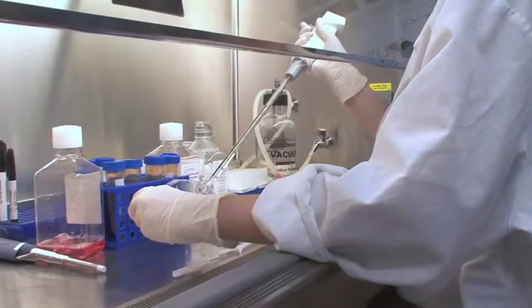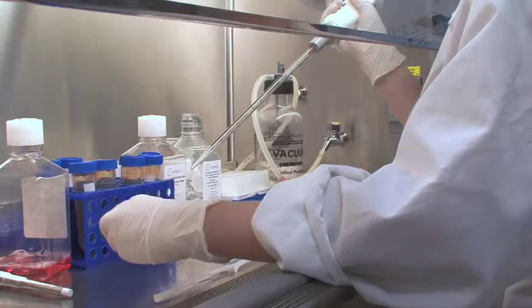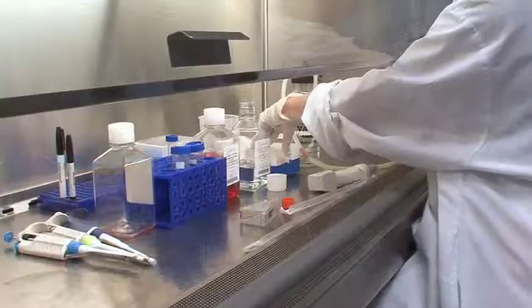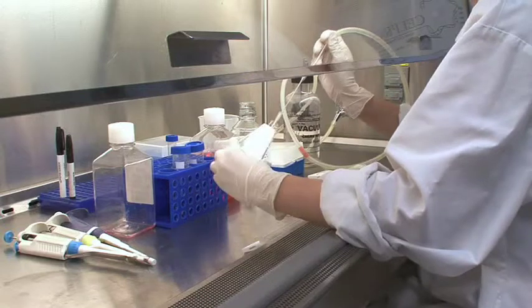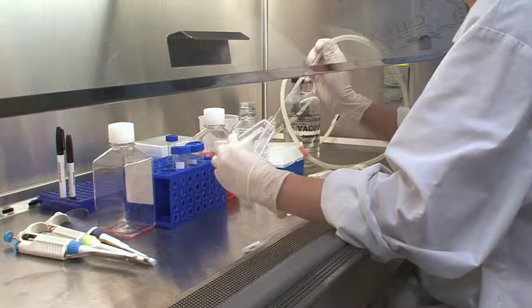With the remaining attached cells in the T75 flask, wash with 3 milliliters 1x PBS solution. This is from Celprogen catalog number P1408-013. Note, in the T25 version of the protocol, wash with 2 milliliters of the 1x PBS solution.